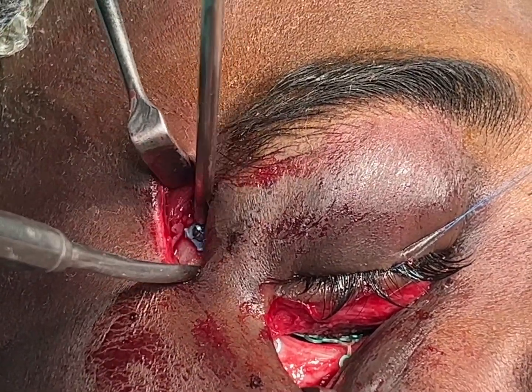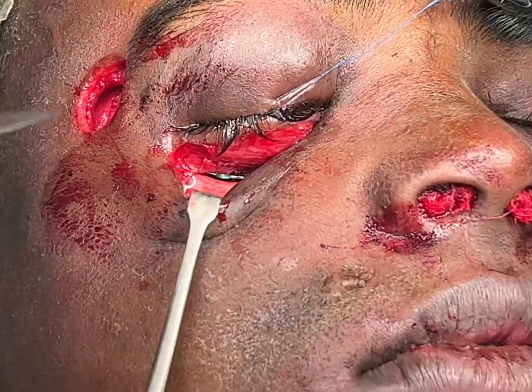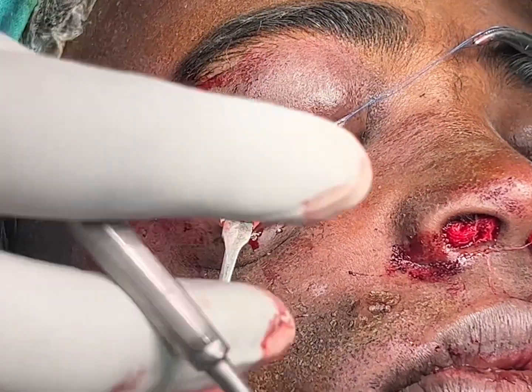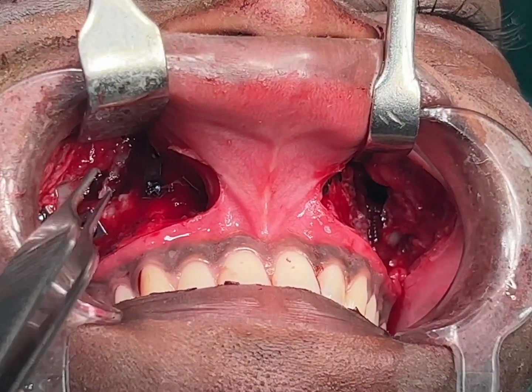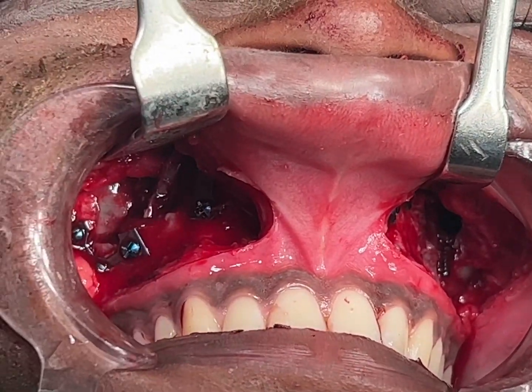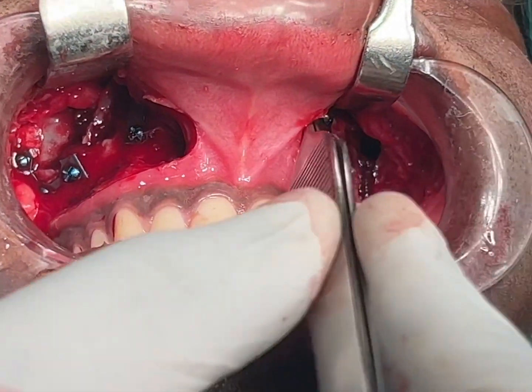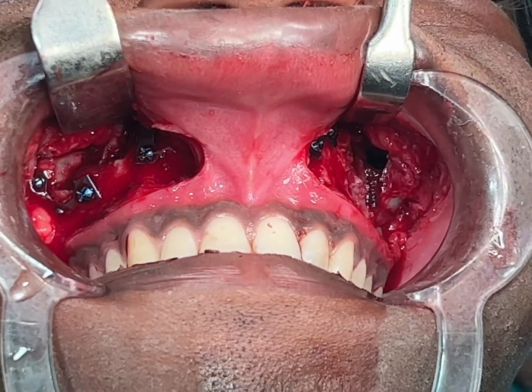This is a 2mm plate with some 6mm screws. We've also done some work intra-orally to take care of the patient's upper jaw. You can see many plates here and many fractures in the upper jaw — they've all been fixed after being reduced. This is part of the panfacial fractures treatment that we've done.